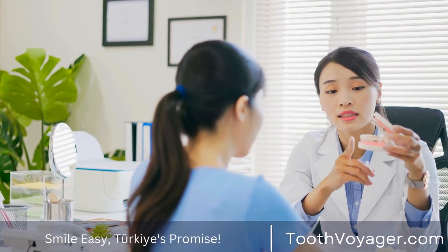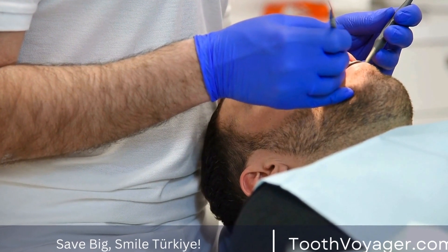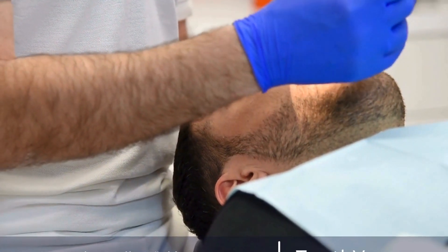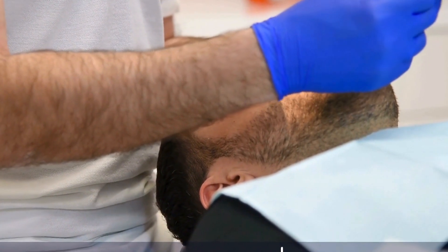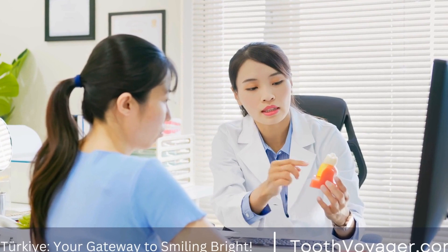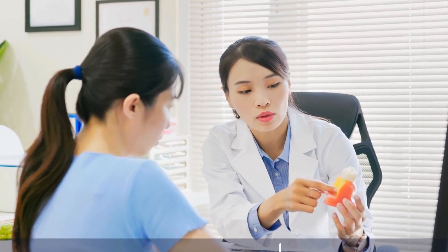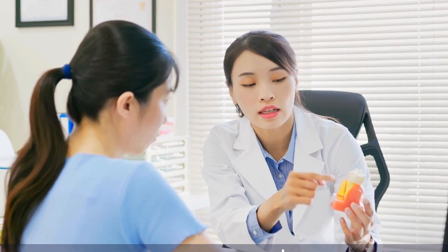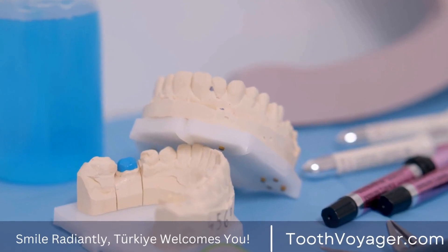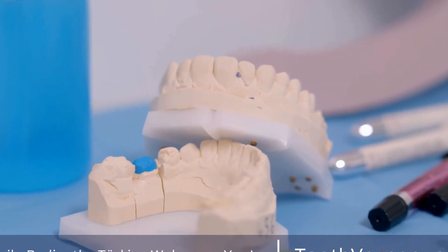CAD-CAM Technology. Computer-aided design and computer-aided manufacturing (CAD-CAM) technology have transformed the way dental restorations are fabricated. With CAD-CAM technology, dentists can design custom crowns, veneers, and inlays on a computer and then mill them in-office or send them to a dental lab for fabrication. This streamlined process reduces the turnaround time for restorations and ensures a precise fit for the patient.